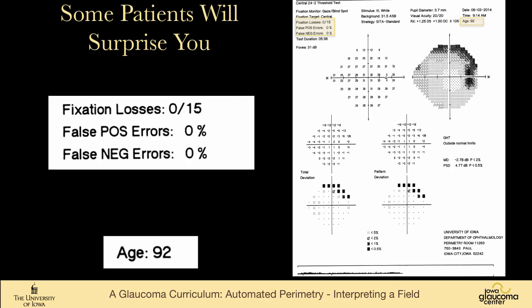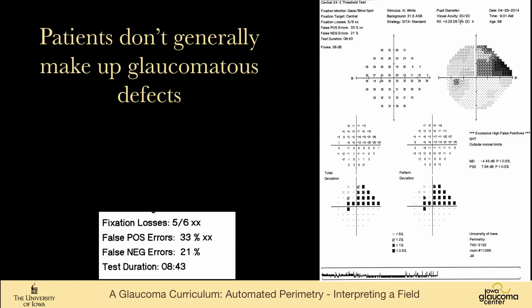An important point is that patients generally don't make up glaucomatous defects. So this person has terrible performance scores. Five of six follow-up fixation losses, 33% false positive, 21% false negative score, gaze tracker that's all over the map. But this defect, this superior arcuate defect that follows a nerve fiber layer and respects the horizontal, is real. But it's telling you that you don't want to follow this patient for subtle changes if they continue to have this sort of performance characteristics.